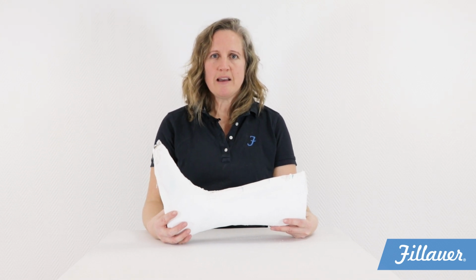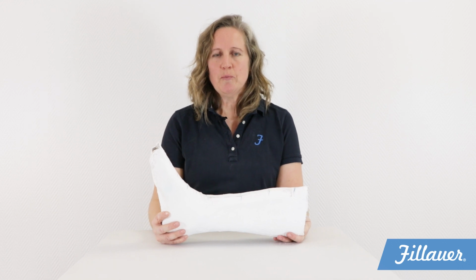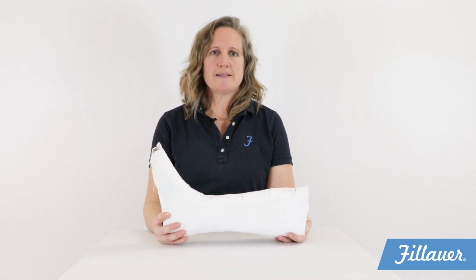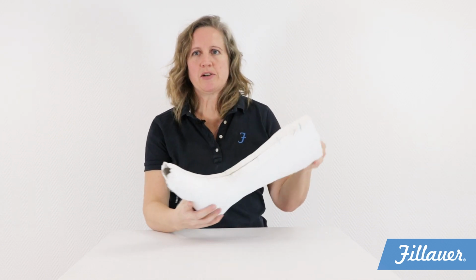You should also check that the plaster is stable so it won't deform. If it's too weak, reinforce the cast. You may use synthetic plaster, but it's the same thing here. Make sure it's stable and will not deform. Also check the cast is long enough. We need that extra 5 centimeters, so if it's too short, please lengthen the cast.